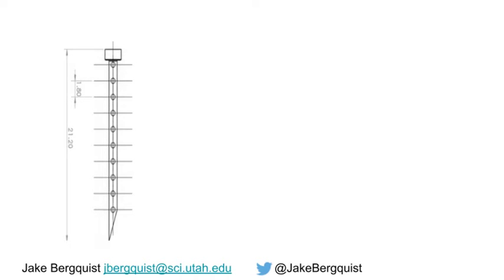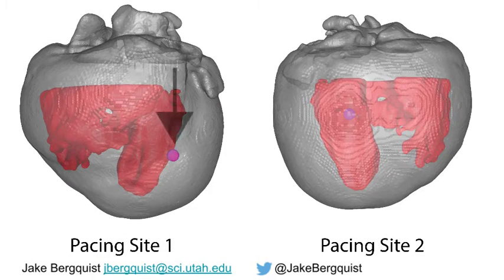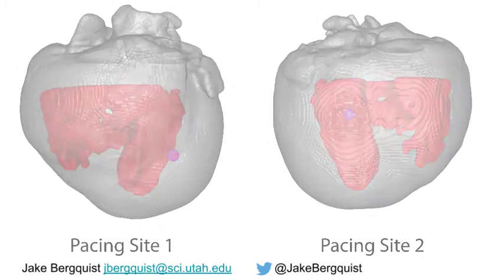In this study, we leveraged this experimental preparation to compare and contrast several common ECGI formulations. The data for this study comes from an experimental protocol where we pace from needle electrodes embedded in the right and left ventricles. We selected two pacing locations, one in the anterior left free wall and one on the posterior left free wall. For each of these pacing locations, 40 heartbeats were isolated from a continuous recording using Pfeifer. This made for a total of 80 heartbeats examined during this study.